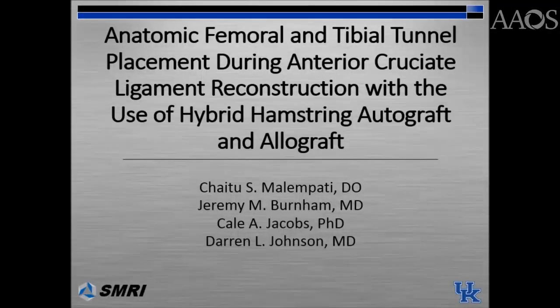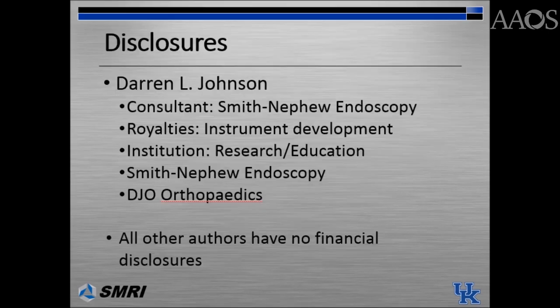This video will demonstrate anatomic femoral and tibial tunnel placement during anterior cruciate ligament reconstruction with the use of hybrid hamstring autograft and semitendinosus allograft.